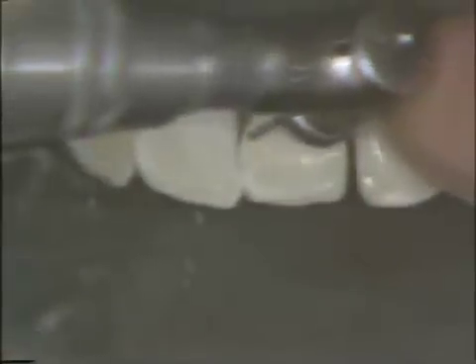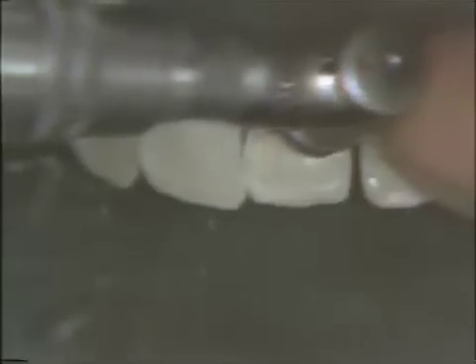The straight fissure burr, a 55 or a 56, is now utilized. Using this burr, we will only cut enamel with it. This is very important. Only enamel. This does not cut against the axial wall, the dentin, at all. Just into the enamel itself. This smooths it off. It gives us a cavo-surface margin that comes at 90 degrees with the tooth. And then you will bring the burr out toward the lingual and smoothing off that margin as much as possible.